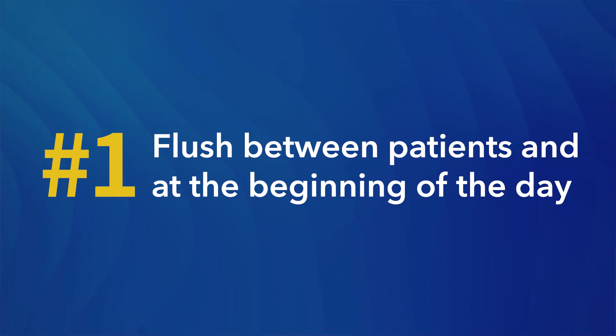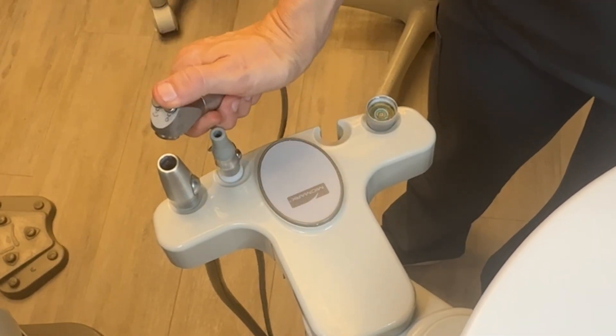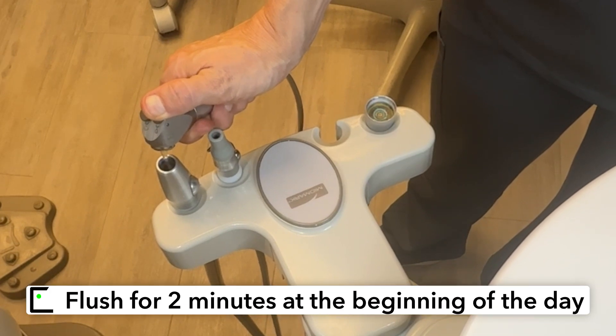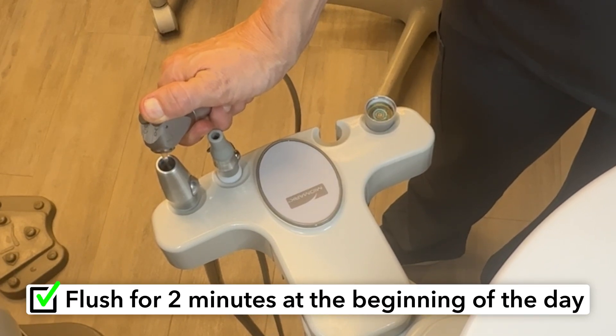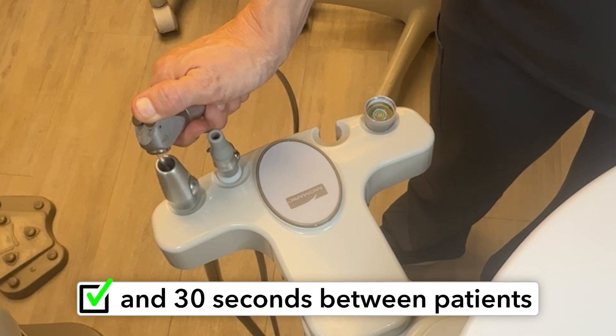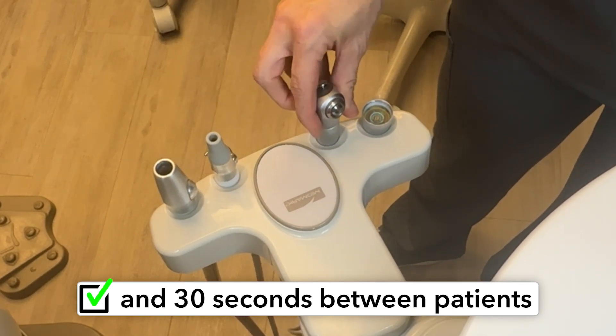Tip number one: flush between patients and at the beginning of the day. Flushing your water lines at the start of each day and between patients is a simple yet effective practice to maintain water line safety. Stagnant water in the lines can allow biofilm to form and grow. By flushing your water lines for two minutes at the beginning of the day and for 30 seconds between patients, you dislodge forming biofilm and reduce the bacterial load.